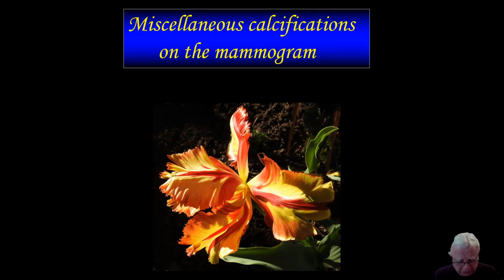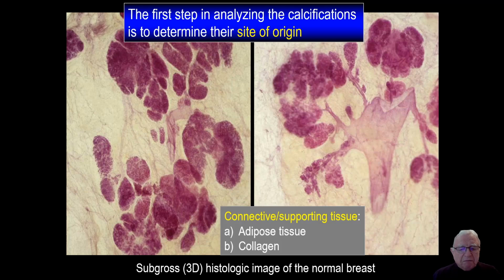I am going to start with talking about miscellaneous calcifications on a mammogram. Let's go back to the basics very quickly.